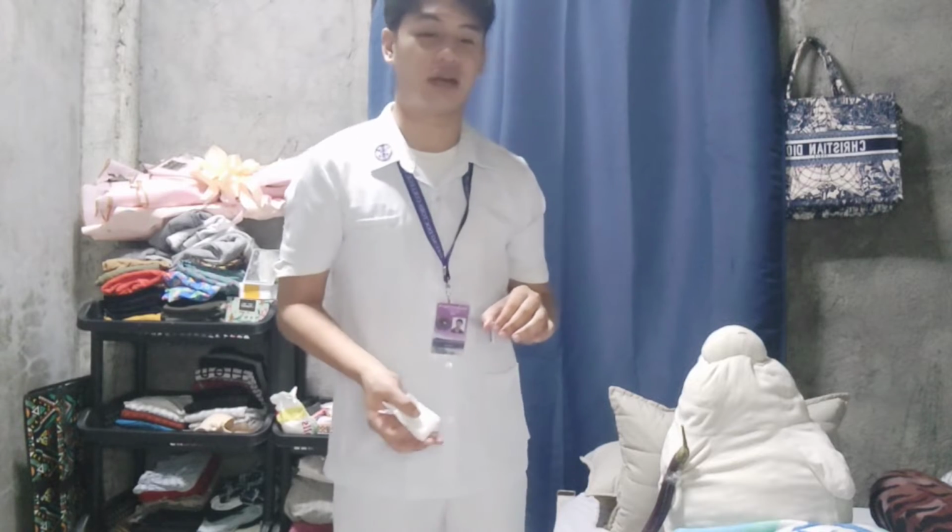Next is withdraw the medication. Place the ampule on a flat surface to secure that the ampule will not fall down to the ground.